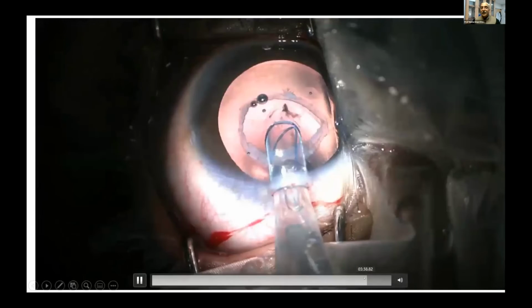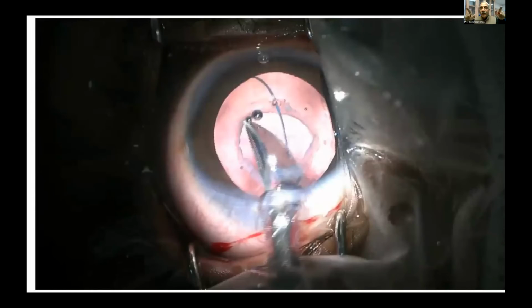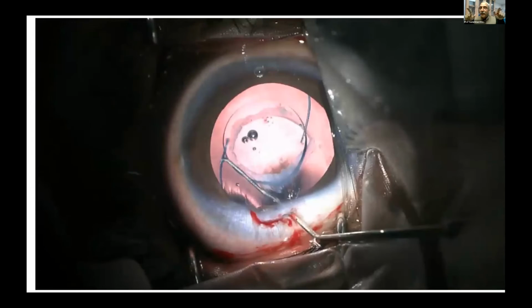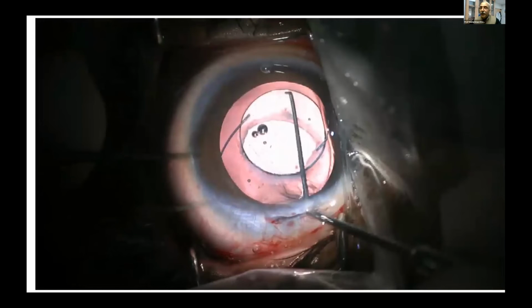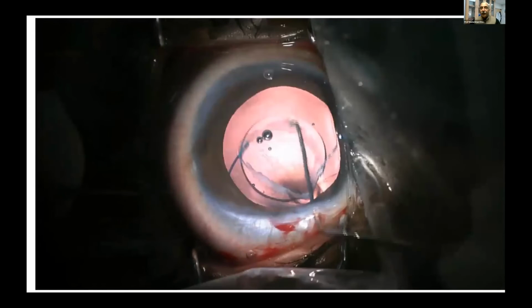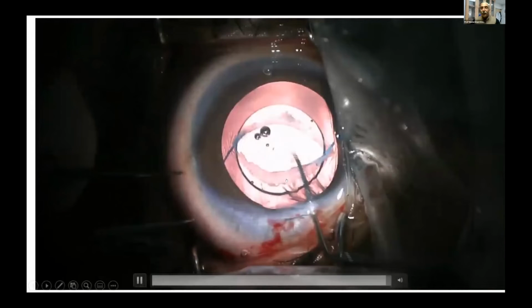And on the UBM we measured, and this eye again, I'm putting a 3-piece implant. Whenever I find my white to white diameter is more than 13 millimeter, and my bag diameter inside is also about 11 to 12, I'm putting 3-piece lenses as a capture. It works wonderfully well. And see, there's a little fibrotic scar in the front. In fact, that is going to help me to keep the lens in place, and that's how beautifully it looks like.